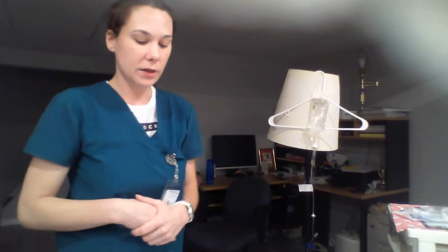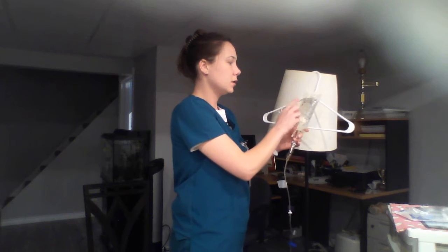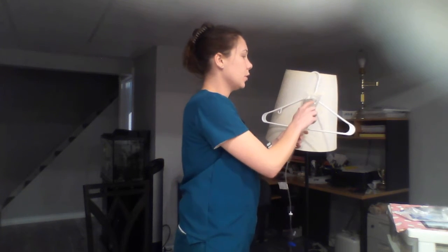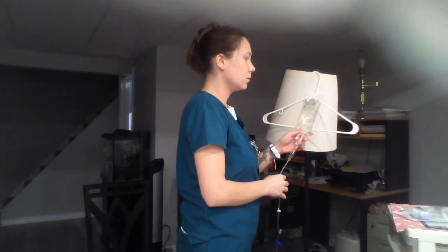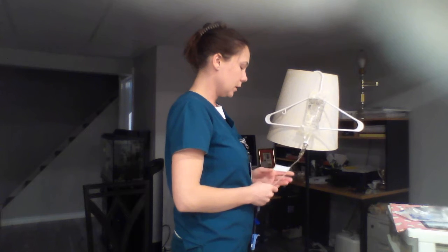So I'm going to want to go into my patient's room. I'm going to introduce myself as Caitlin Jarvis, and I'm a nursing student from Durham College. I want to just go in and assess that it is the normal saline that's running. I want to check the expiry date, December 2000. Perfect. I want to ensure that it is labeled.